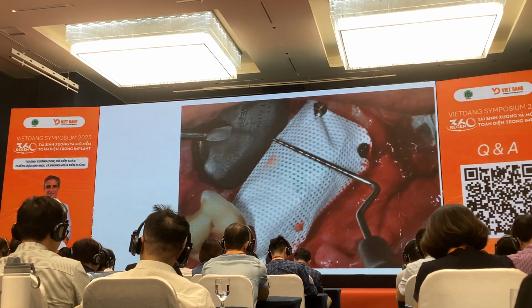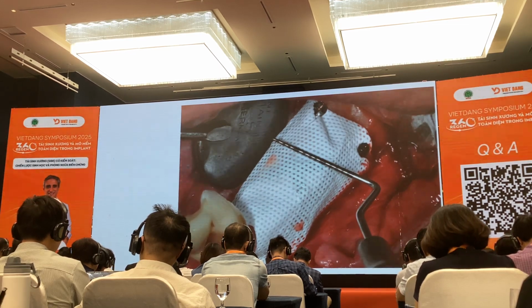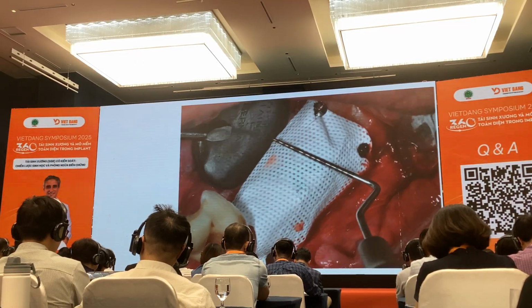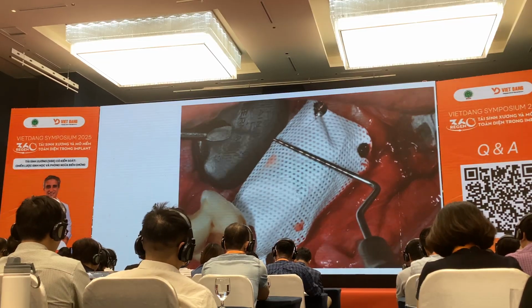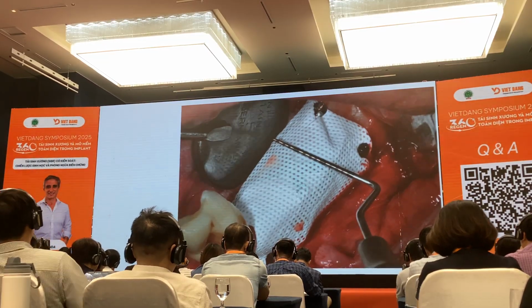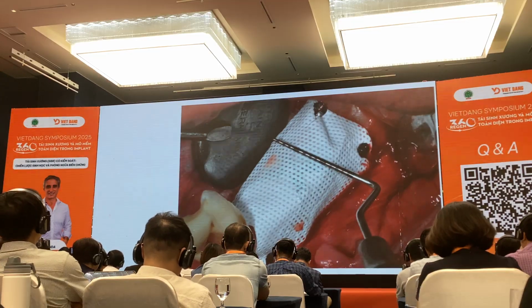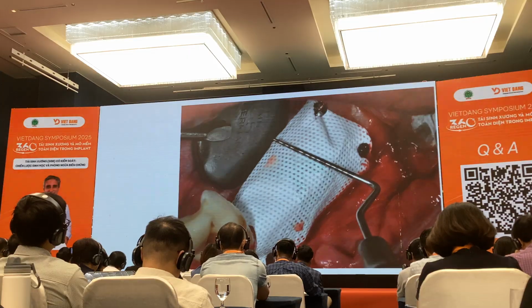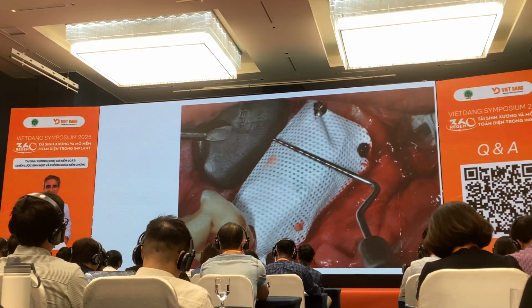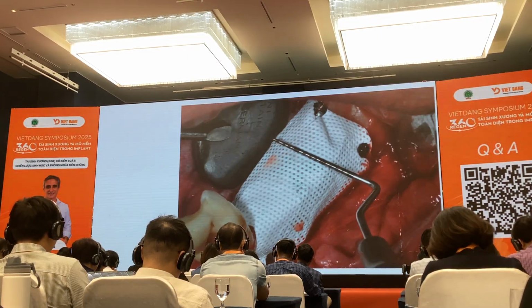It is true that now we can gain an improvement in the quality of the bone through the periosteum contact, with the increasing of the mineralization and of the corticalization.